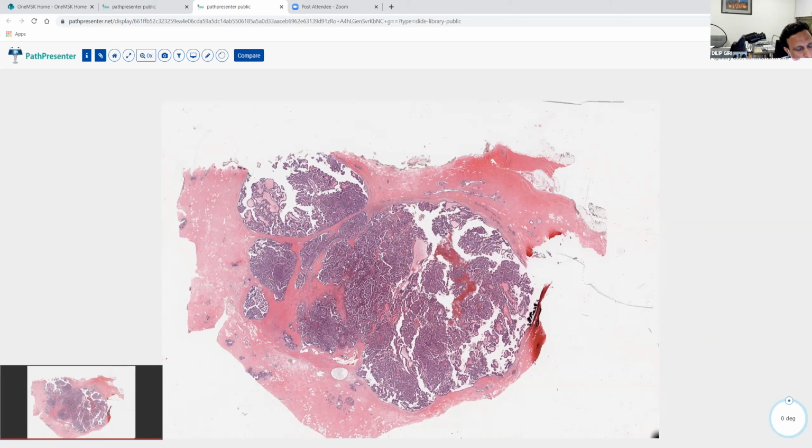So if you do a myoepithelial stain in this scenario, it may or may not help. If you see, for example, a good myoepithelial layer everywhere else, and then it is totally absent here, then that will support your assumption that there is invasion, right? And that would be like an objective. Nobody is going to question that.